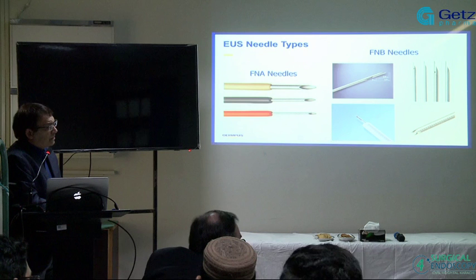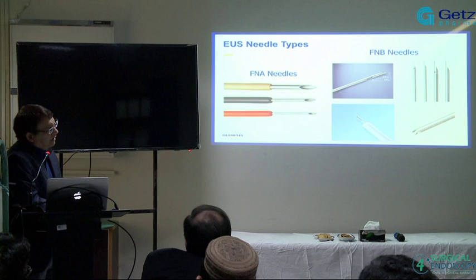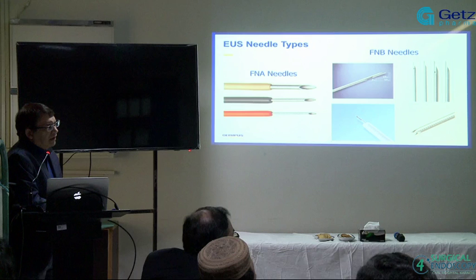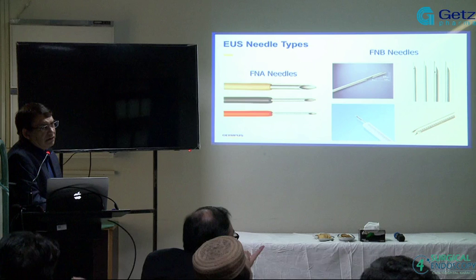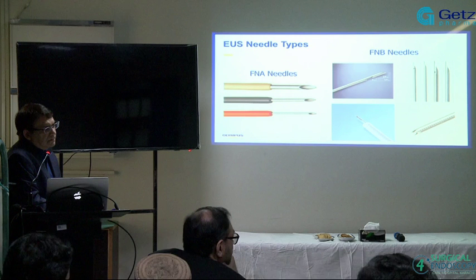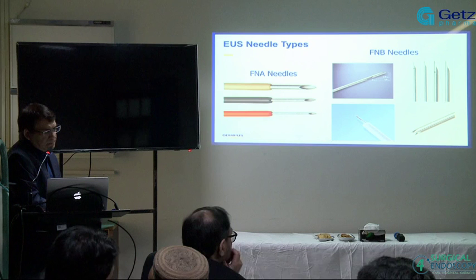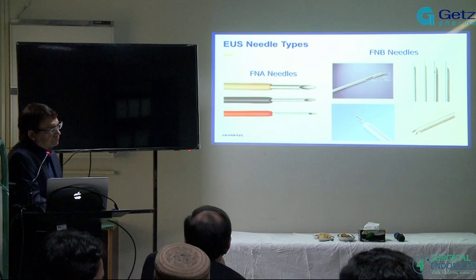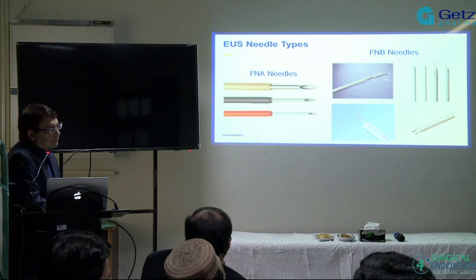Yeah, there are so many needles available. It really depends. What about the Cook? I use Boston and Cook. I mean, if you give any needle, you'll be able to put a needle through it. That's not a problem. But we have Boston, you've been comfortable with it, and so we just continue using it. You have more experience with Boston, and probably cost.